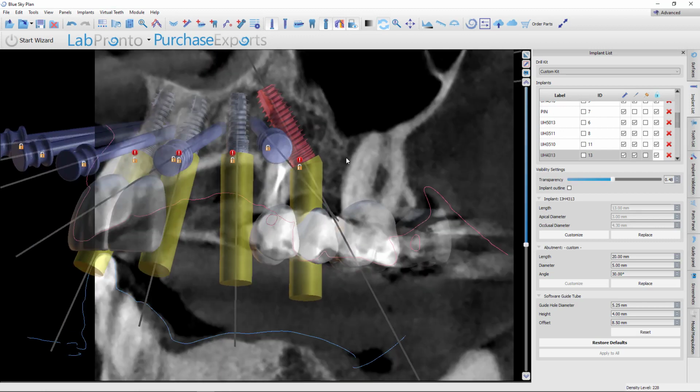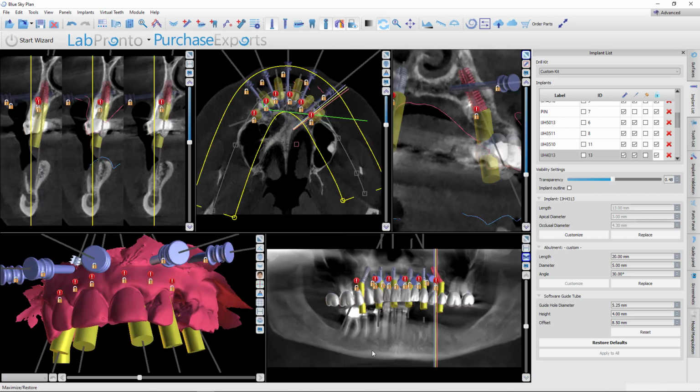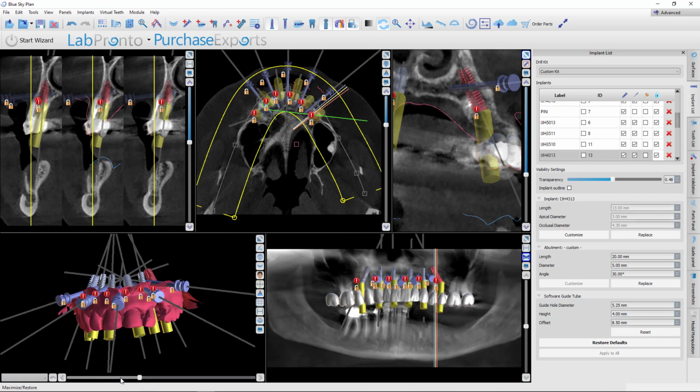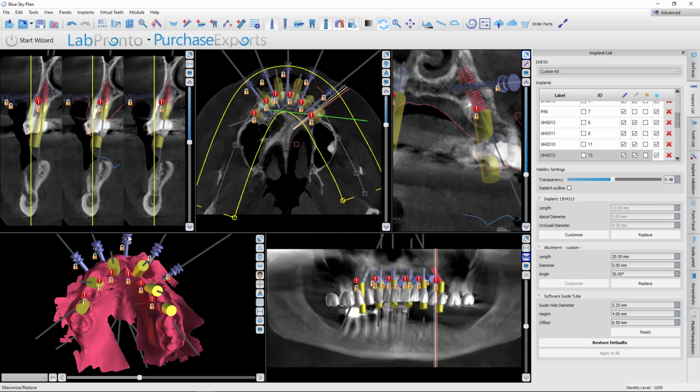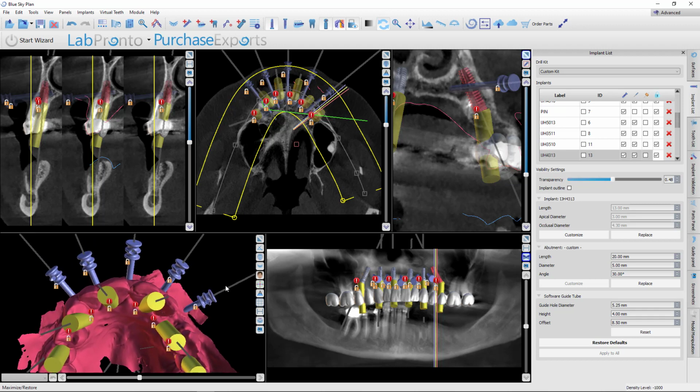So no real infection risk. We've got pins placed in between each of these implants, and it may seem like I've gone overboard with pins, but one thing to realize is when you're doing these on patients that already have an existing dentition, if those teeth end up being really difficult to get out, sometimes you might blow out a buccal plate. So let's say if I'd only put 3 pins in, and in the area of this canine, I was to lose the whole buccal plate. Well, now that pin is worthless. So err towards more pins than less. You'll never regret having them there. You may not use them, but at least you've got them. But if you don't have enough, that's going to create some difficulties for you.